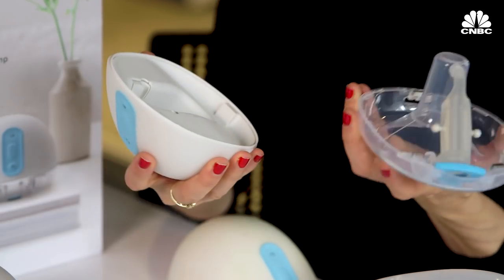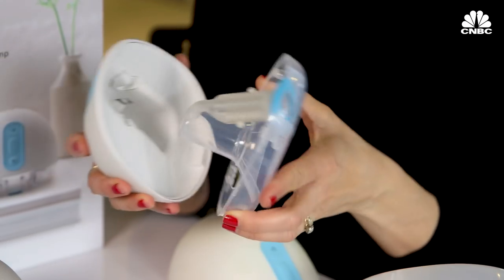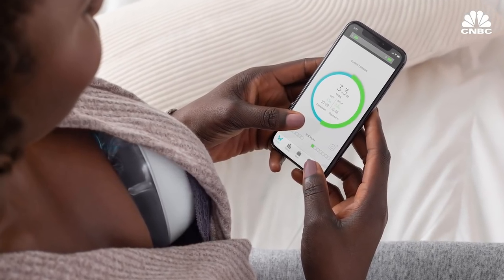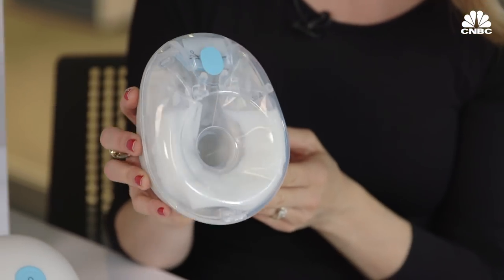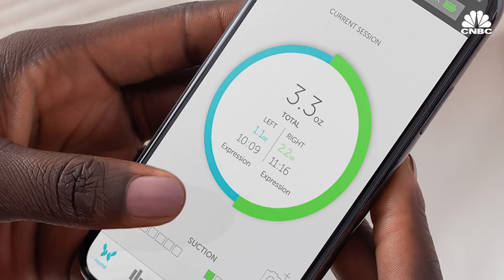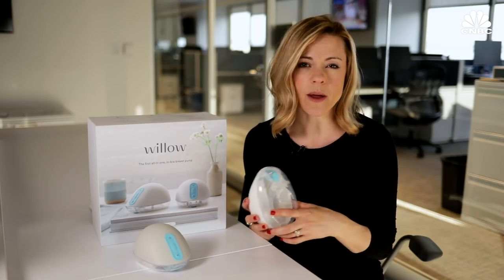Willow fixed this with the new version of the pump, since now it's see-through with a clear flange. Pumping moms will now be able to see how the pump aligns on their nipple and also can watch the milk flow. Before, the only way to see how much milk was flowing was to watch the app. Now moms will be able to pump without even using the app.